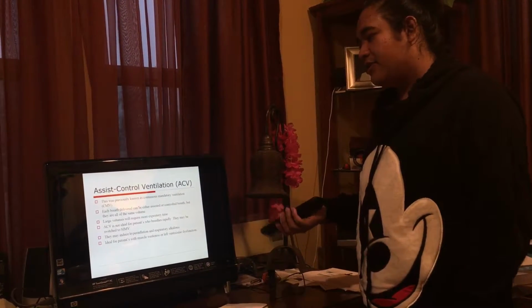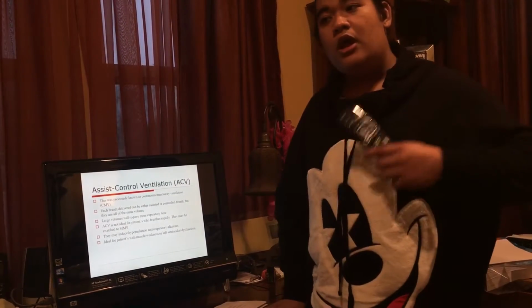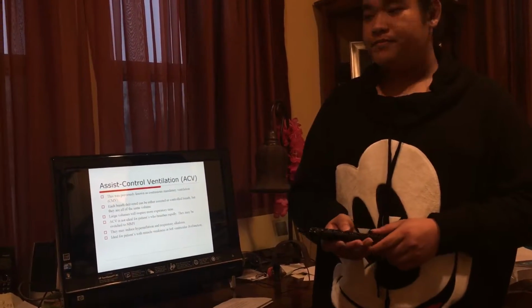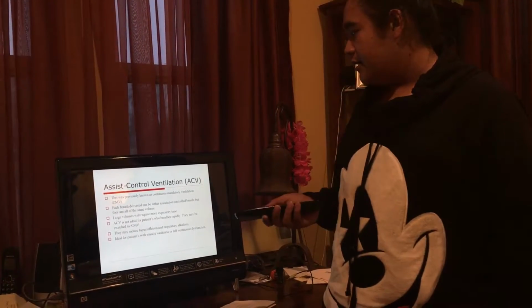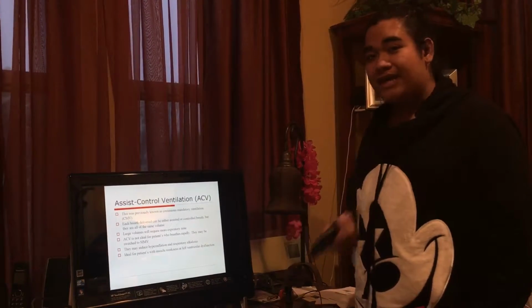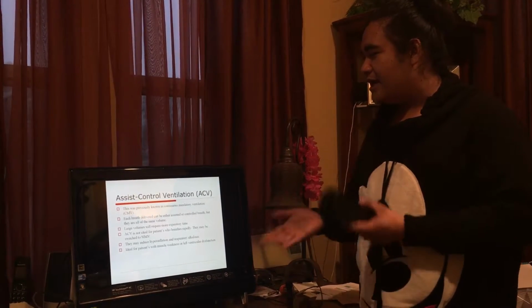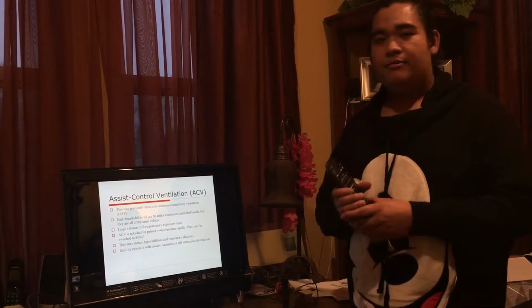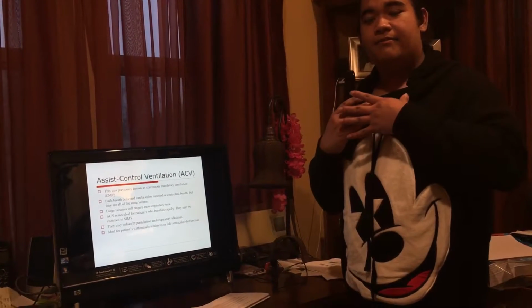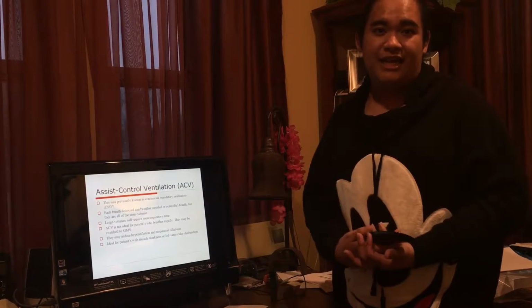This is also very ideal for patients who have neurological diseases that cause muscle weakness, like myasthenia gravis, or other diseases that could potentially induce muscle weakness. Why is that? That's a good question to ask yourself every time: why is volume control good for patients with muscle weakness? It's good because we're giving a set volume that the patient's body is demanding.